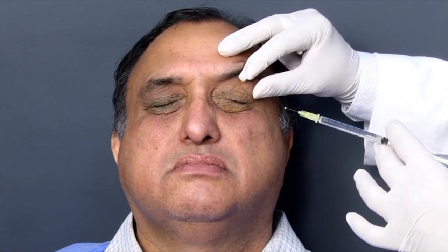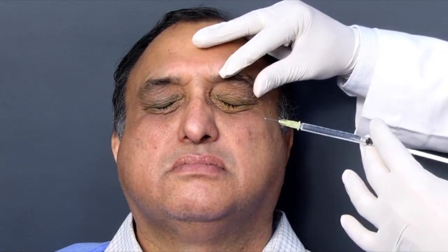The non-dominant hand helps to show the areas where I am going to inject. Because the patient is going to have spasms while we are injecting, it is necessary that you hold the spasms away while you inject. So let us begin with his left side.